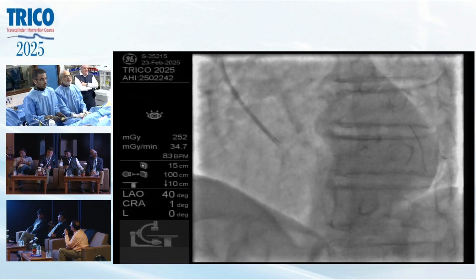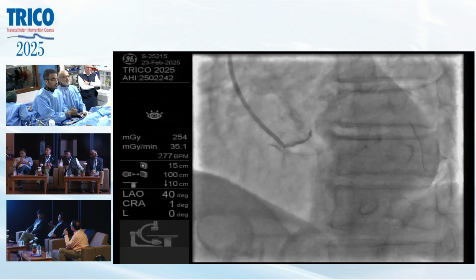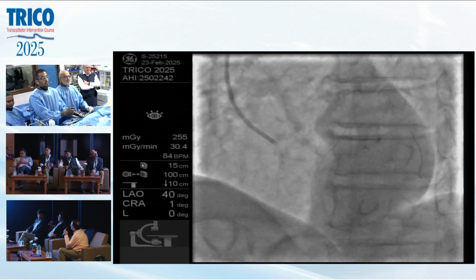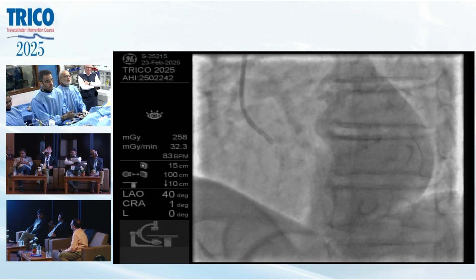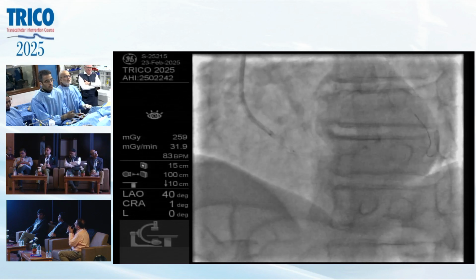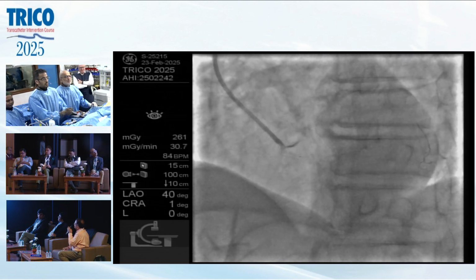deflate, inject, a little bit off center, yeah. Off center. I think it's a directly down pointing takeoff. Yeah. And the Amplatz is flat down. Curve. That is probably closer now.